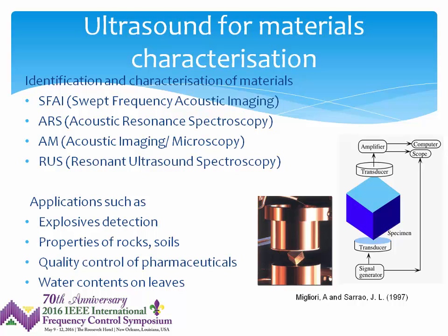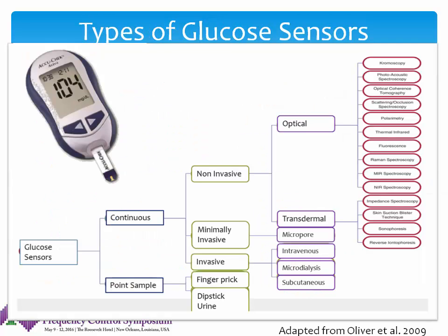So if you confine the specimen space, there's some interesting information to potentially be gathered by applying these sorts of techniques. Okay, so that's the wider field of ultrasound-based materials characterization, and the previous very brief encapsulation of the previous work in the area. We get into glucose sensing.